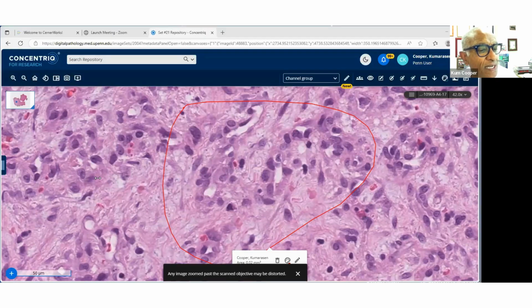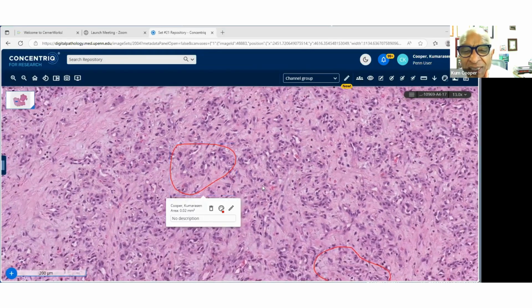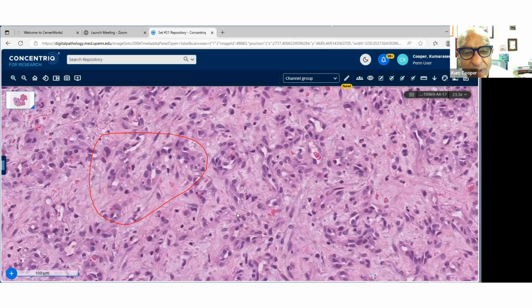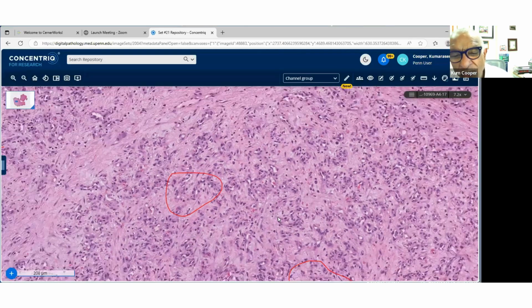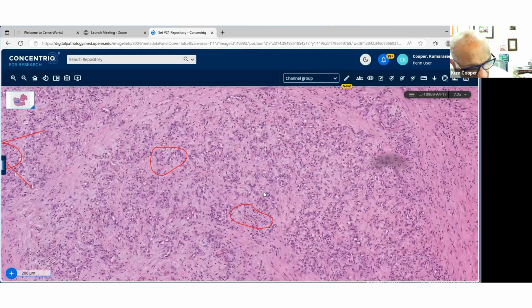All right. And Kaposiform hemangioendothelioma, yes, they look like Kaposi's. Let's look at Kaposi's, and again, easily ruled out because you can do an HHV8 these days and rule that out. Typically spindled lobules, short fascicles, and they have hemosiderin and plasma cells in the stroma as well. And they are multinodular as well. So you can rule that out in this context because I mentioned renal transplant and you all went for immunosuppression, but somebody here went for bacillary angiomatosis. Thank you very much.